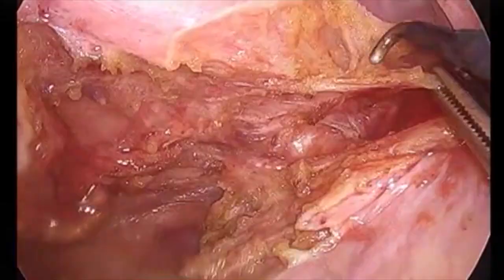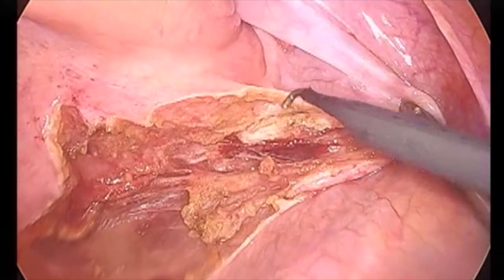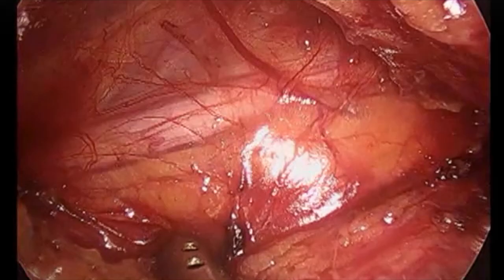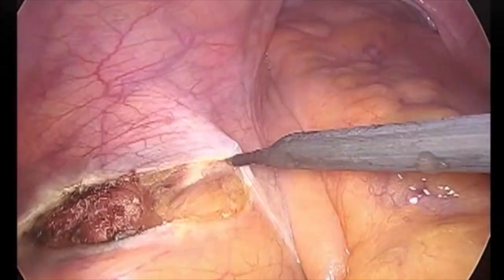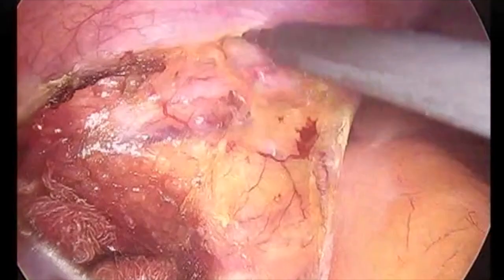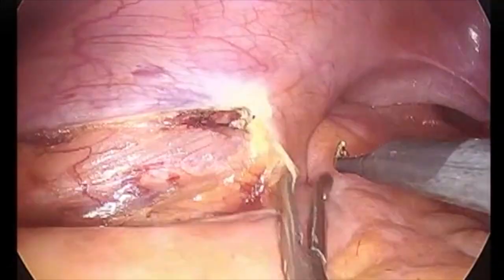Those are the presacral nerves. The right lateral and posterior dissection is continued. There's the right ureter. You can appreciate the peristalsis of the left ureteral wall. Once the posterior and right lateral dissection is over, the sigmoid colon is flipped to the right side by the assistant surgeon, and incision is made on the peritoneum of the left lateral pelvic wall. Care is taken to identify the ureteral gonadal complex and it is pushed down.